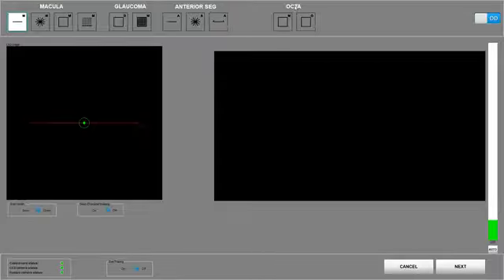For the OCTA scans, you can select the OCT macular angiography, and you can select the OCT optical disc angiography. At the bottom of the panel, you can select between the 6mm scan width or 11mm scan width. You can also select deep choroidal imaging, on or off. And finally, you can activate the eye tracking, on or off, in case you have a patient who is not cooperating very well, or if you want to have follow-up images.